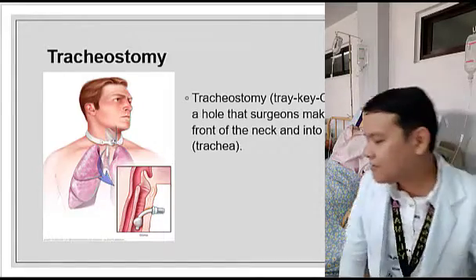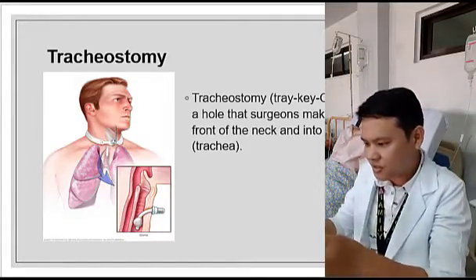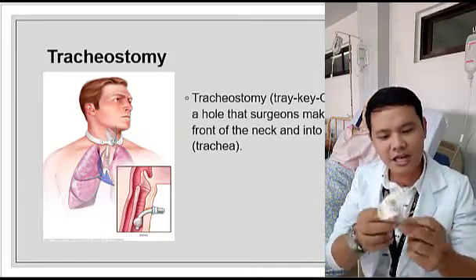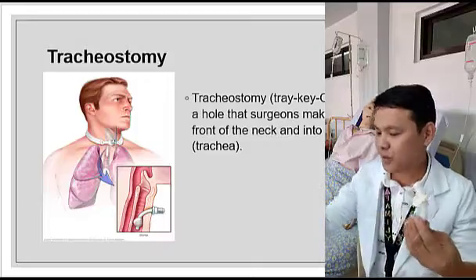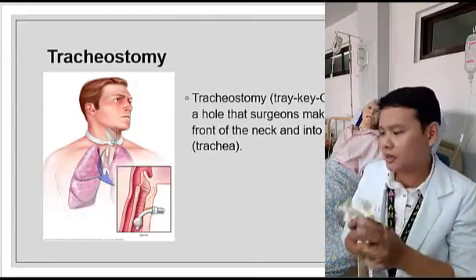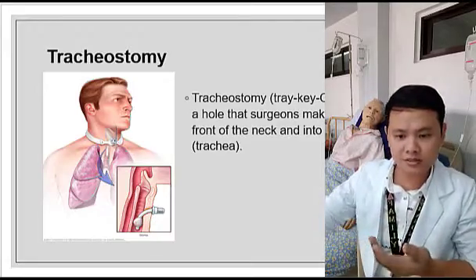Okay? So I have here some of the tracheostomy tubes that we usually see in a hospital. This one is actually plastic. Okay? We have different kinds of tracheostomy tubes actually. So later on, we will discuss about this tracheostomy and also its parts.